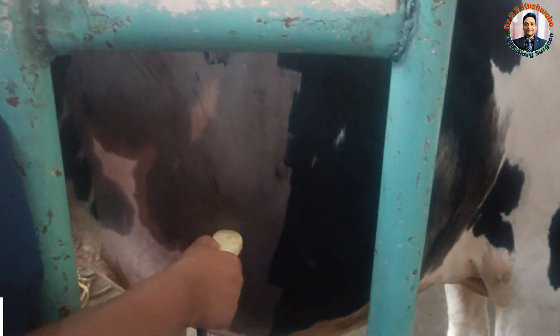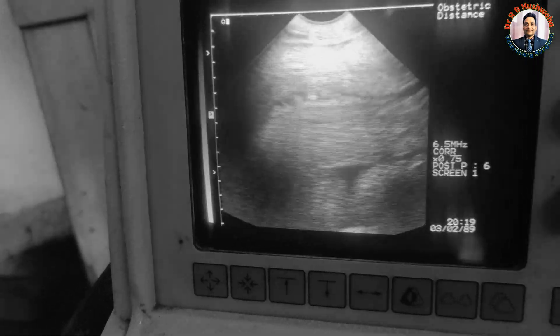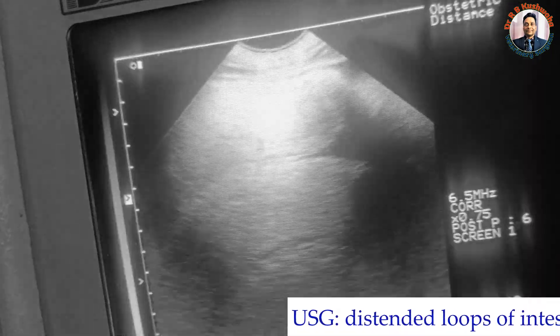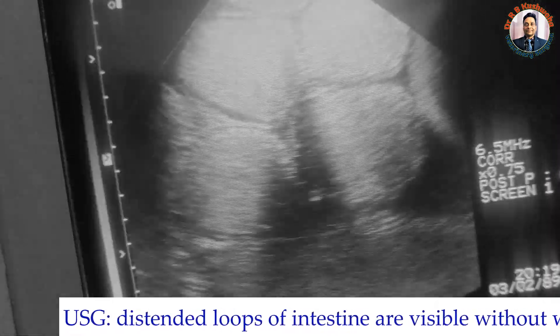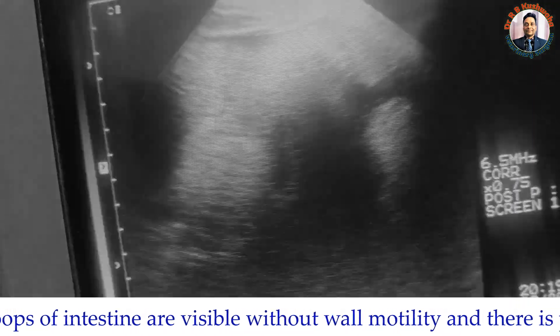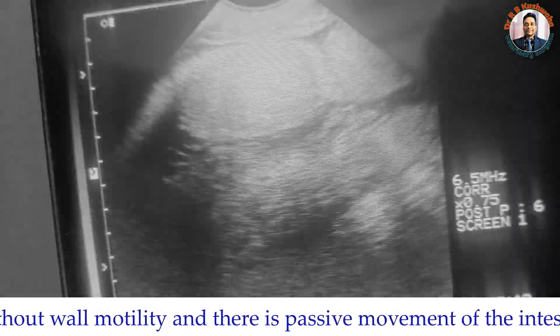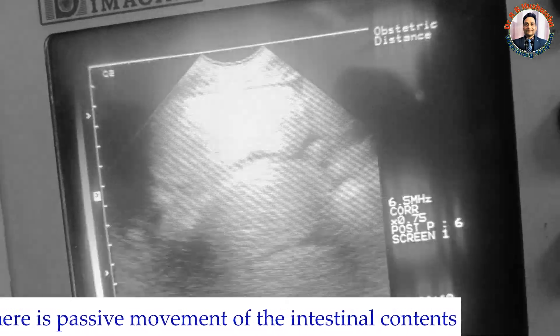In that case we went for ultrasonography. You can see we scanned the whole right flank area. Whenever there is intestinal obstruction, we will find distended loops anterior to the obstruction. You can see the loops are bigger and there is no motility in the wall — only passive movement of the content.